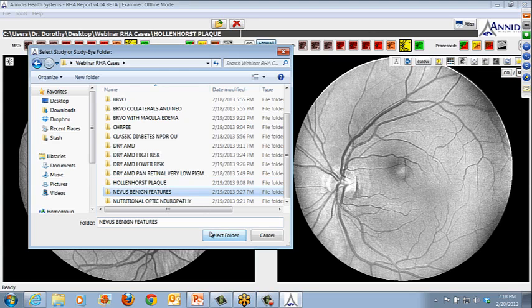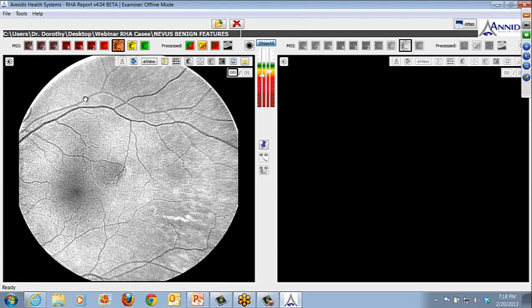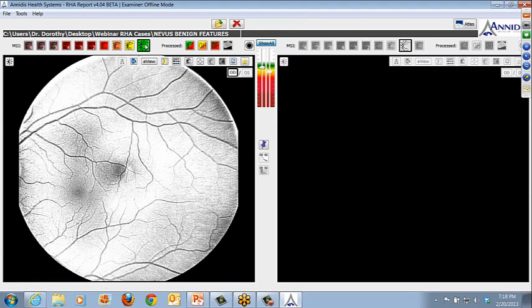So I'm definitely going to pull up a nevus here and just one eye. And this is something that I think is a very useful tool with multispectral imaging, helping further differentiate, but also importantly follow nevi over time. Okay, so there's a lot of controversy in the literature, despite the fact that we have the Collaborative Ocular Melanoma Study and some other large scale level 1 studies that have nicely sorted out what features constitute malignant features and what are the things that we should look for in following nevi over time.